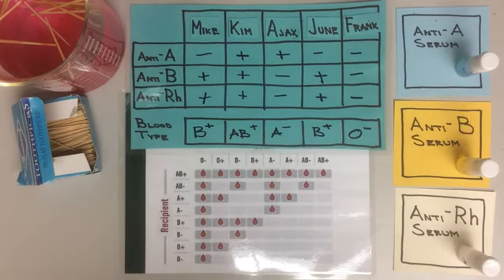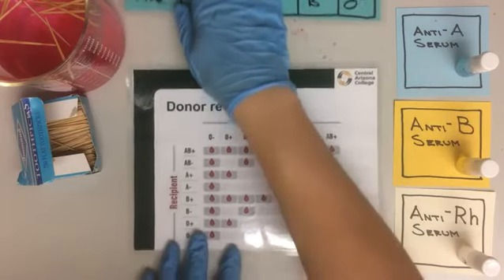There you have it. I hope that we have managed to bring some real-world relevance to these donor-recipient interactions that we talked about earlier on.